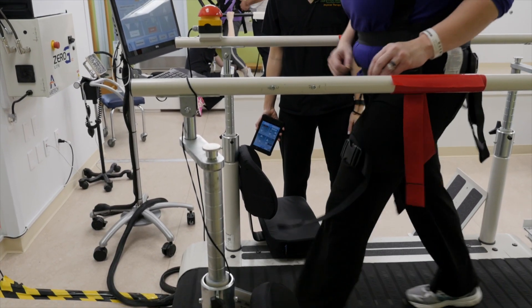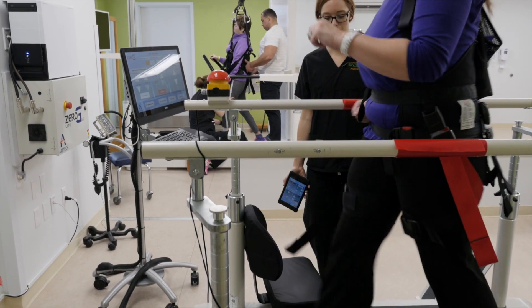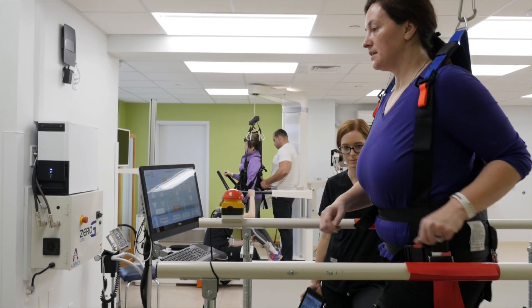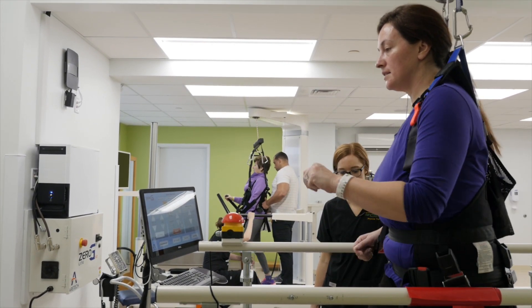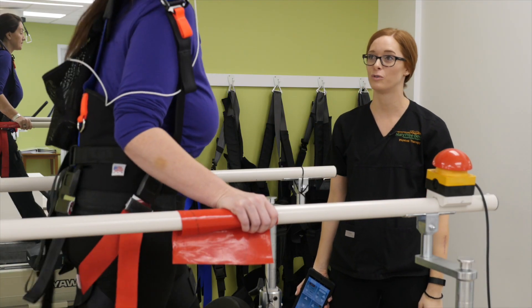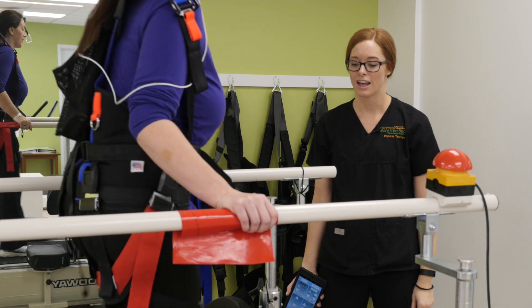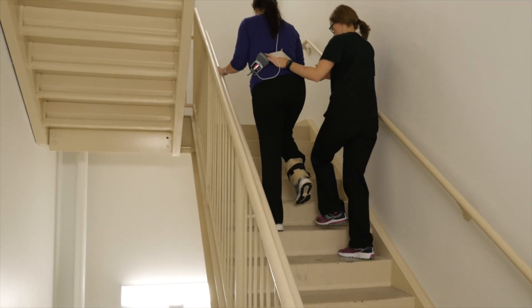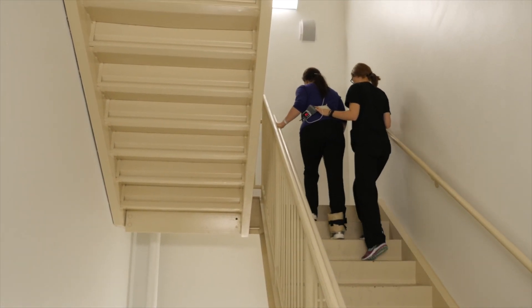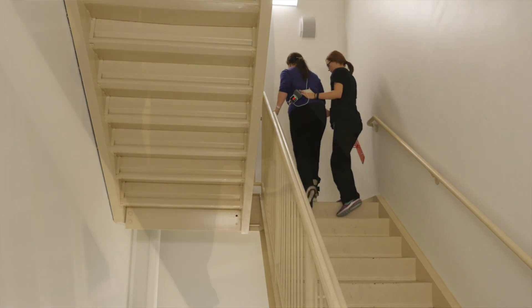If you would have been here the first week, we had a second person stabilizing her, a lot more weight taken off so she could have the endurance and ability to move her right leg, and I was down there working really hard helping her so it wasn't buckling — we weren't going nearly this fast. The end game is she's not on a treadmill with a harness system when she goes home, so she has to feel comfortable on the ground too, and we do a fair amount of challenging things without the treadmill.